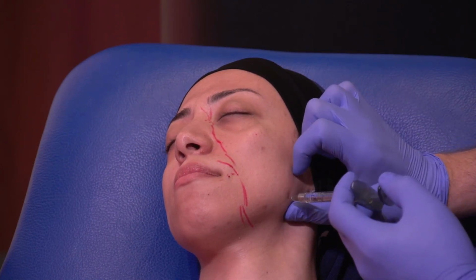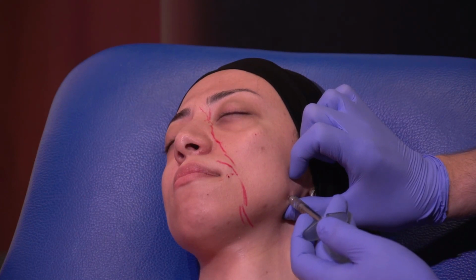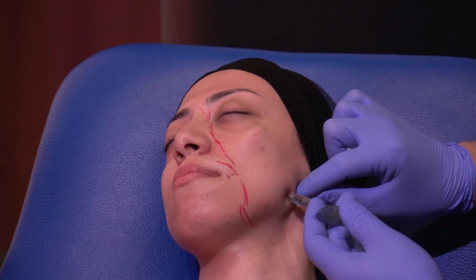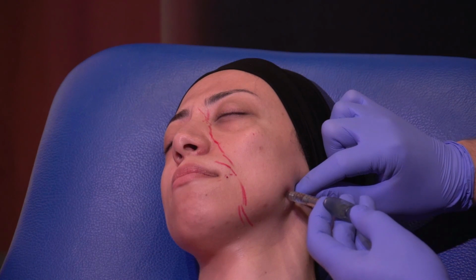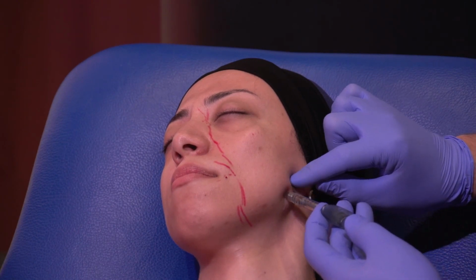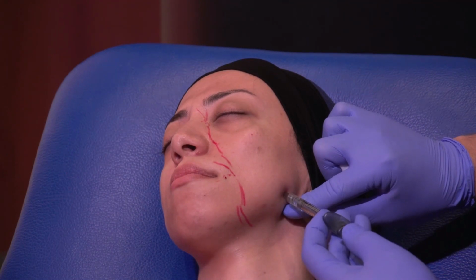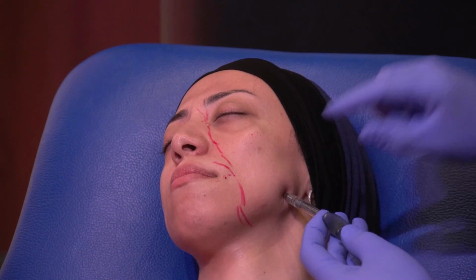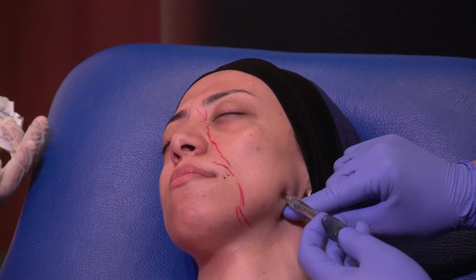And then again, manipulate your needle. Stay in the skin. This decreases infection and pain. And I go superiorly, again, on the bone. All my needles in this area are on the bone. Aspirate and then inject. Perpendicular in the first site, and the other sites are a little bit angulated, just because I don't want to puncture her again. If it's always perpendicular, you're puncturing the skin more times.